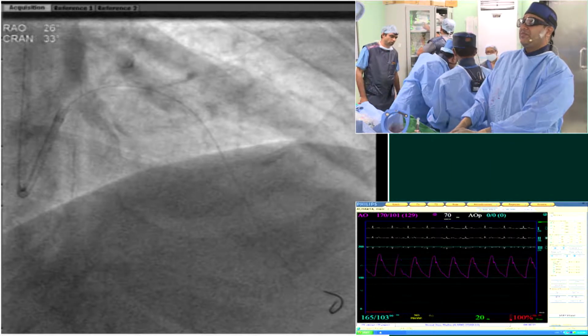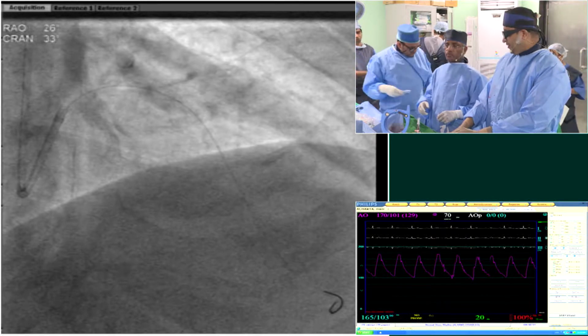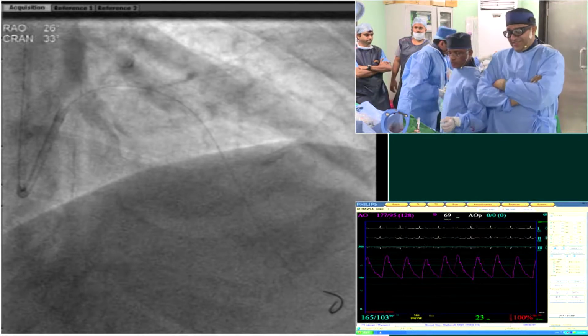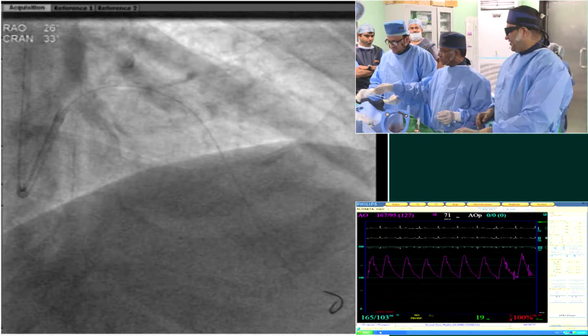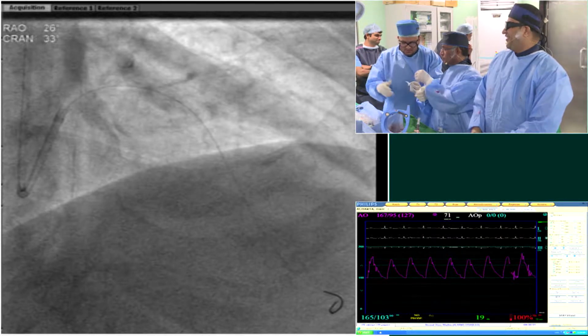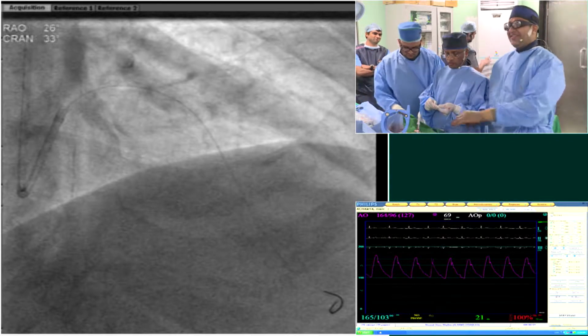Yes, I can hear you, Dr. Callan. So this is Keith Allen. I'm the thoracic surgeon on this panel, and I'm looking at the angiogram, and I'm going to be contrarian and say you've got a nasty proximal diagonal, a juicy distal target. Your LAD distally is a good-looking target, and your OM's got a tight lesion in it over there too that I can see.